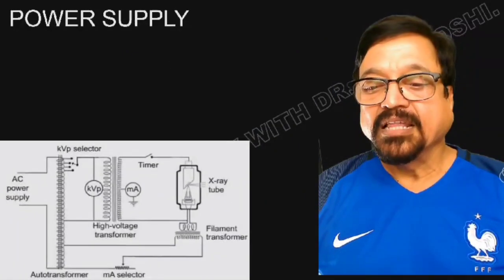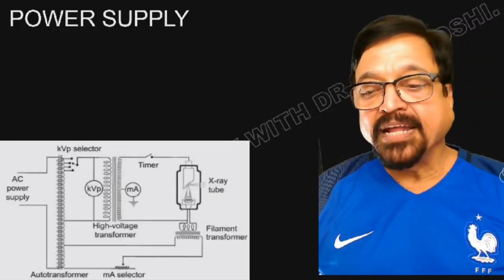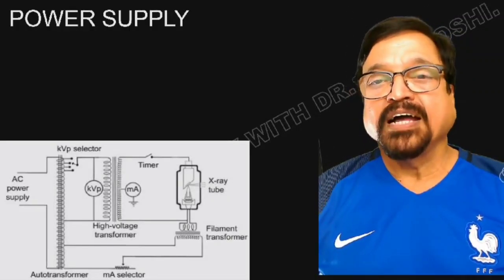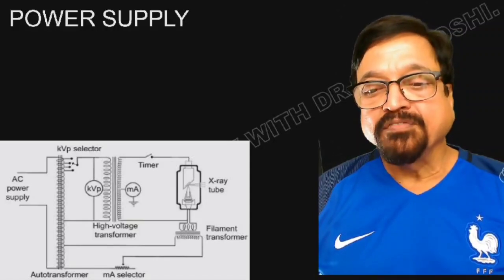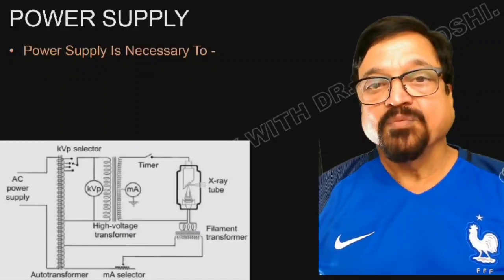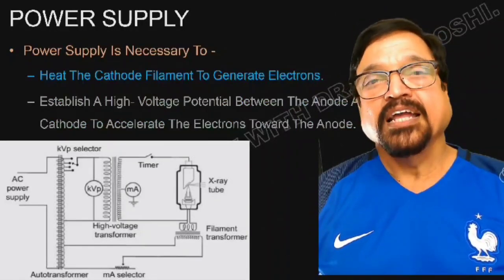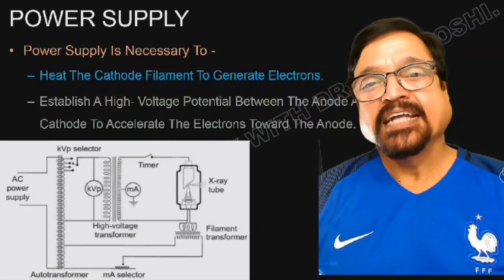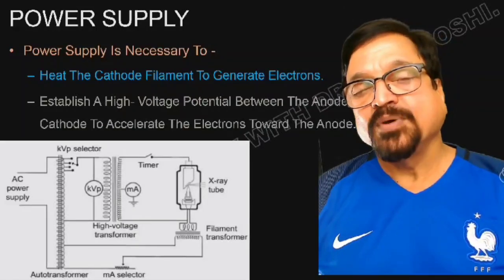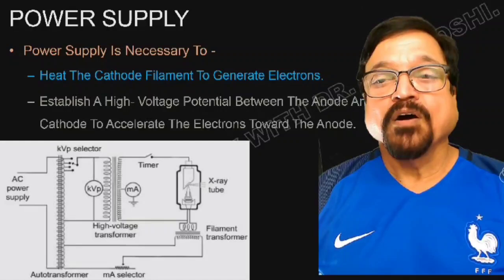Now this is the tube we had discussed. Now power supply is by a generator. Now we can see here primary, secondary, different types of generators used to give different types of power to the different units. These are all discussed in detail in another lecture. We have another lecture in this same series in short, condensed form, and also in an extensive form in another lecture series. Both are available, condensed as well as larger or in detail.